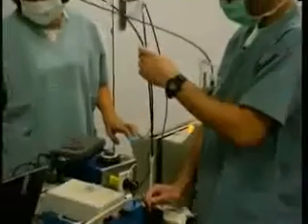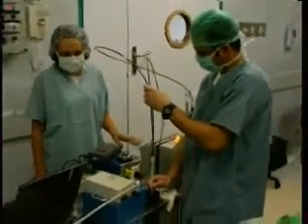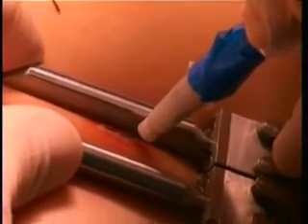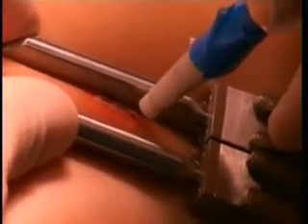The fact that we can develop a small instrument that can bond tissues and you don't need the great skill of the surgeon — that you simply have an instrument that maybe will be in every hospital or in an emergency situation, where a less qualified surgeon or a medic, if there is a cut, can do it exactly like they do it in the Star Trek television series. So it's science fiction made real.